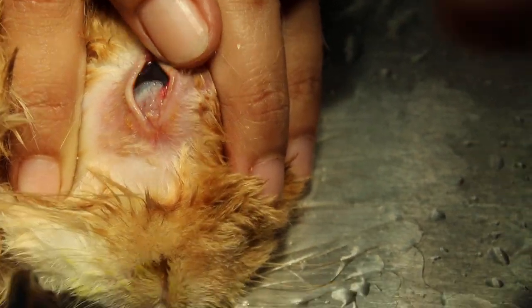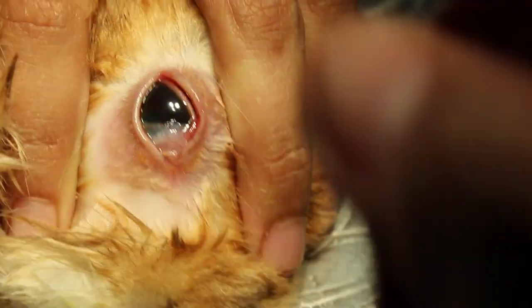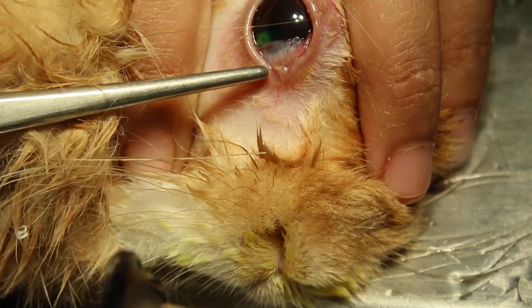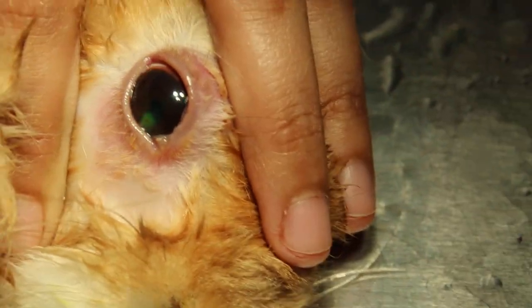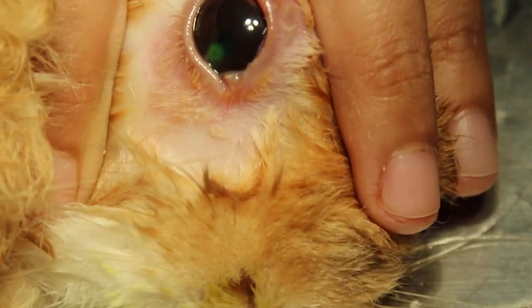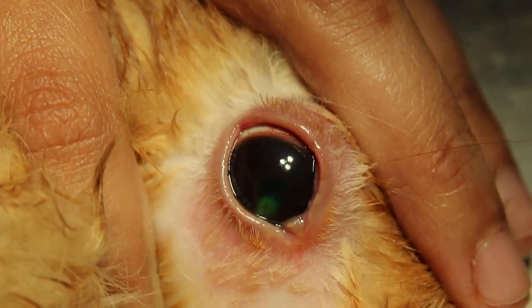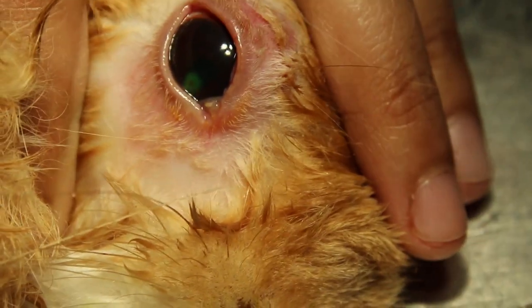Is it viscous or something? There's something across. You see the third eyelid is okay — it's pink. The third eyelid is a bit swollen. This is not like the other rabbit where the third eyelid is swollen, inflamed, and full of pus. This one has a little bit of discharge on it. So this corneal ulceration is causing the eye to be painful and itchy. It's very hard to wear a collar so you get an e-collar.